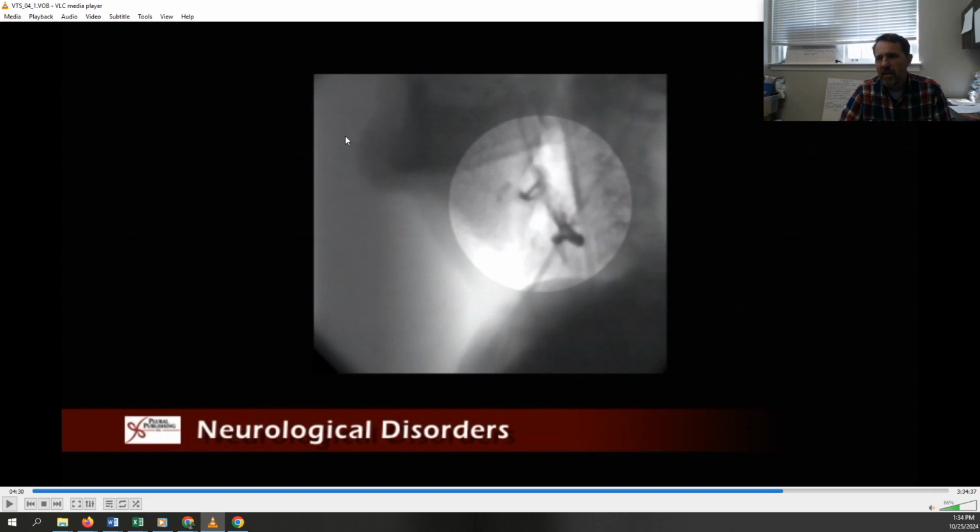All right, this is a messy looking image, but here's the mandible. So here's the chin right there. So this is the ramus of the mandible back here. Here's the angle. So this is the base of the tongue right there.